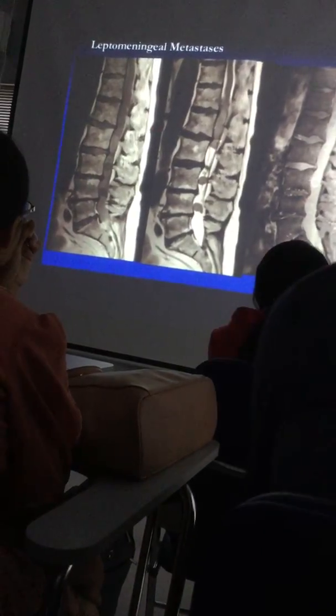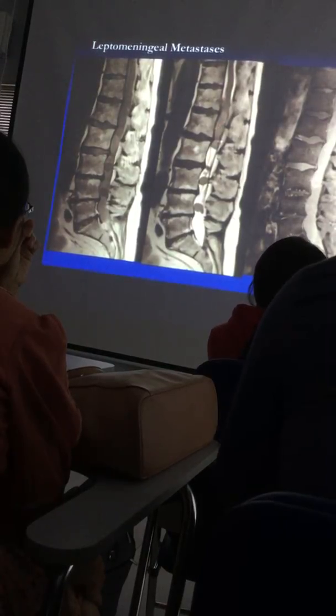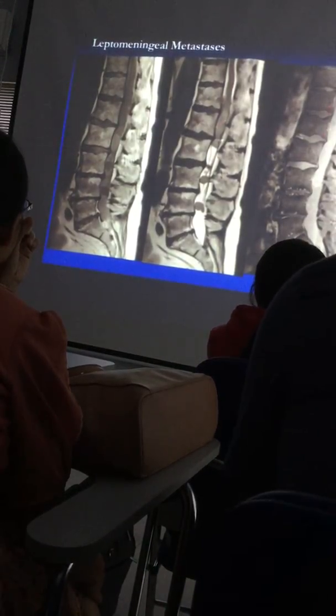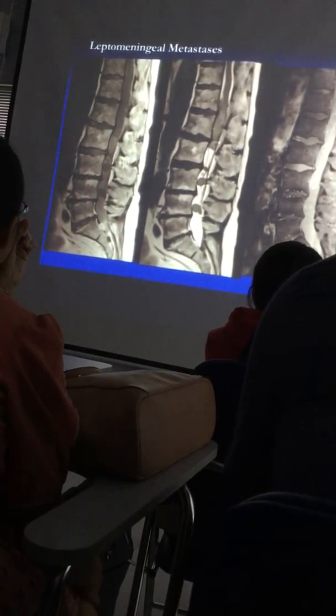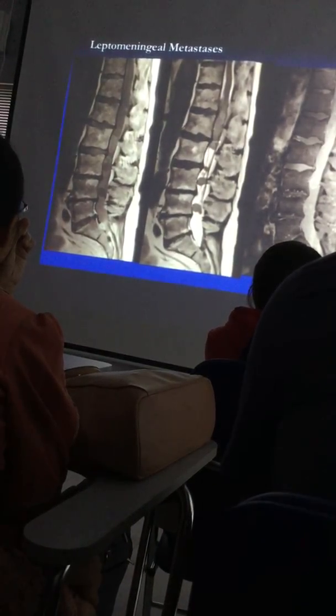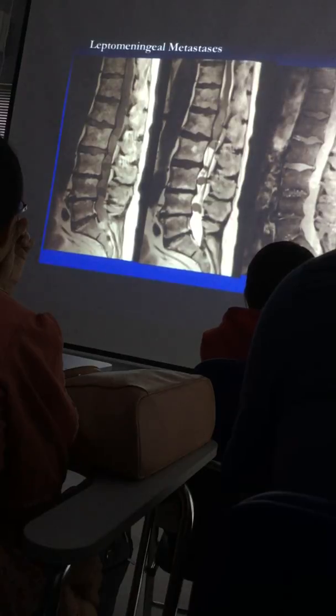Up here is also a further intradural extramedullary lesion that also enhances. So the entire lumbar subarachnoid space is filled with enhancing tumour. Usually you'll see lots of small lesions, but when there are bigger lesions that become confluent, you get homogeneous enhancement in this patient with leptomeningeal metastases.